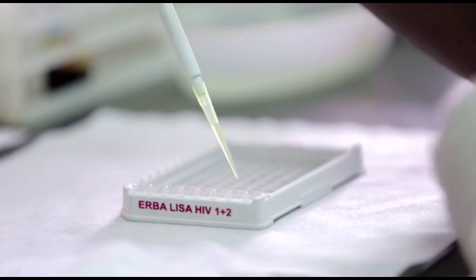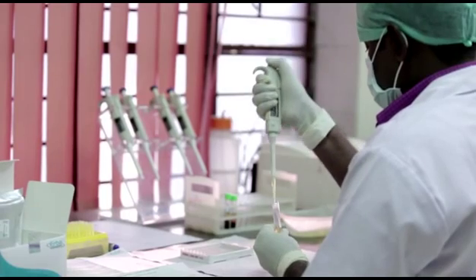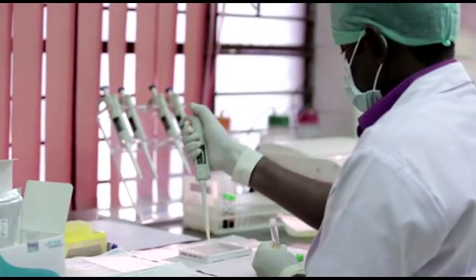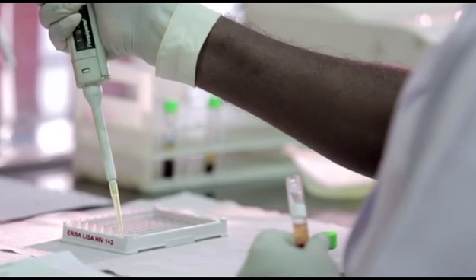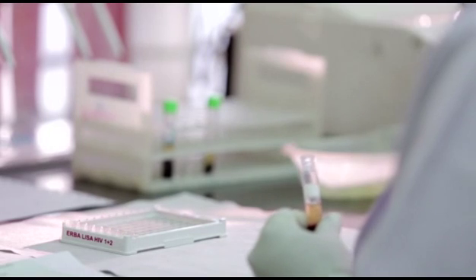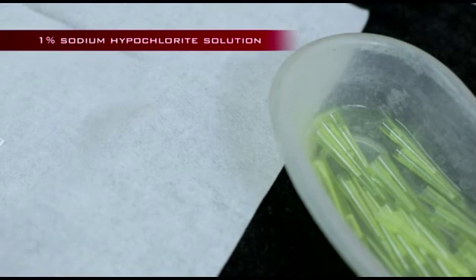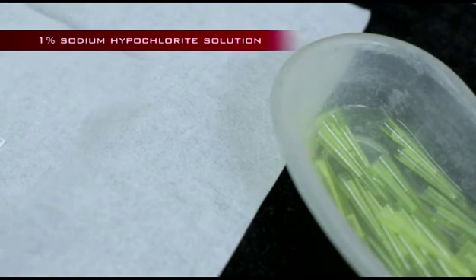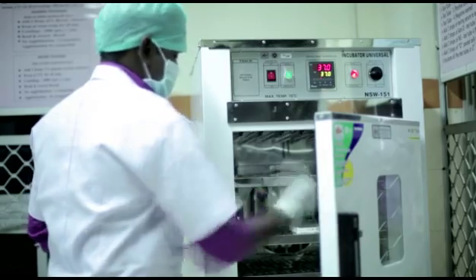Hold the micropipette vertically and dispense the samples into the wells. Do not touch the sides of the well to avoid cross-contamination. Make sure that tips are changed after dispensing each and every sample. Discard the tips in a kidney tray containing 1% sodium hypochlorite solution. Then incubate the microplate at temperature and duration as instructed.